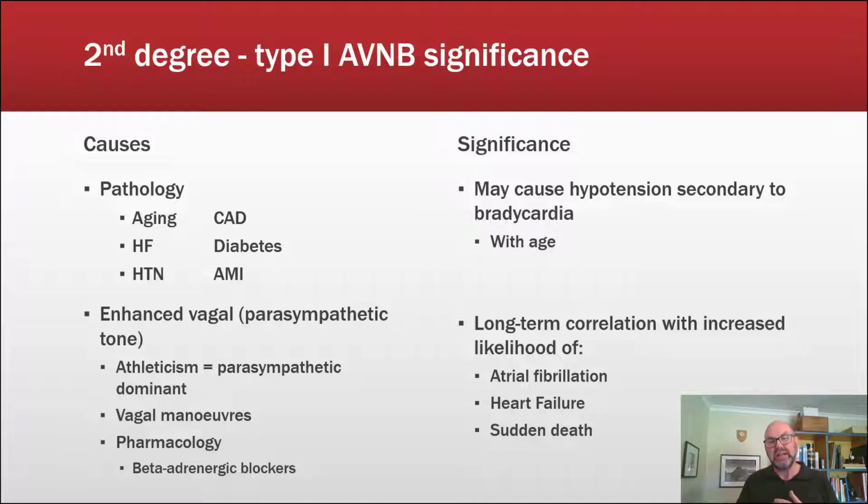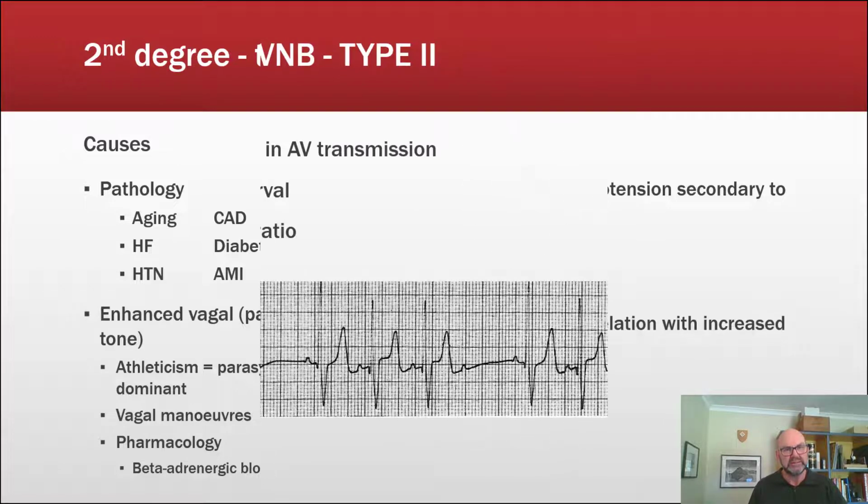Should the discovery of the second degree block be a new finding, it would always be appropriate to transport the person to ED for further investigation. At the very least, you'd want to discuss this with a senior medical officer to ensure that the correct pathway is going to be followed and that there's adequate safety netting for the case.